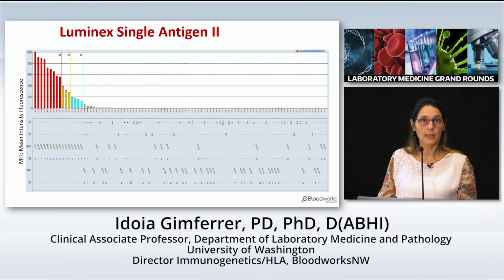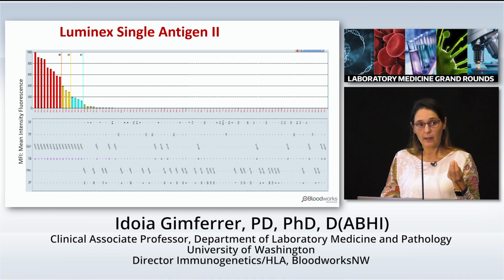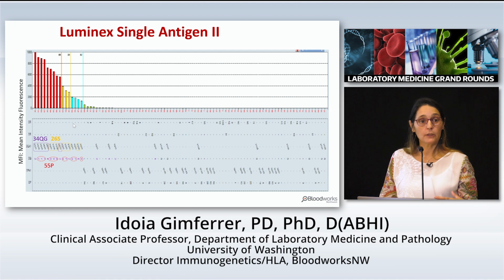And this is how it looks like when we have incubated the beads carrying these class 2 antigens with the serum of the patient. This patient reacted with these beads. Again, I'm trying to look into the epitopes that are really there, and these are the 3 epitopes I'm seeing. And I'm satisfied because I can account for all the beads. So those are the 3 antibodies that are causing this reaction.